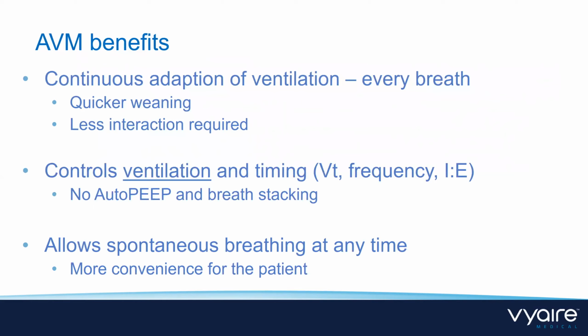So if the patient wants to breathe spontaneously, he can do this whenever he feels to, and as soon as the patient is awake, he can start just breathing spontaneously without waiting that someone switches over to spontaneous. He can just do it. So it's a very convenient mode.